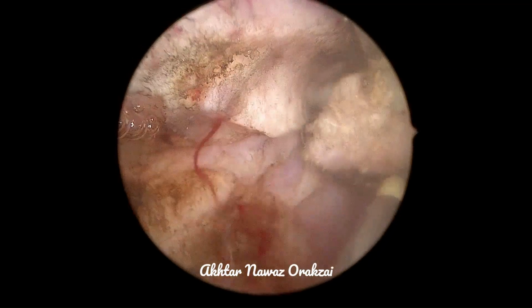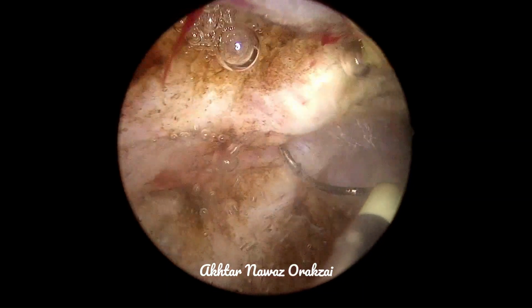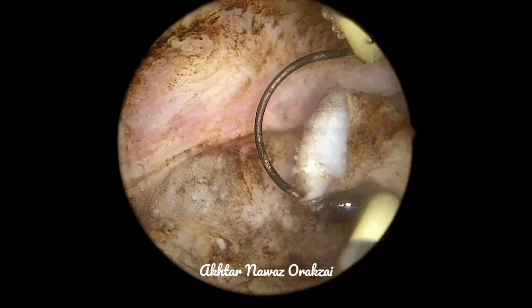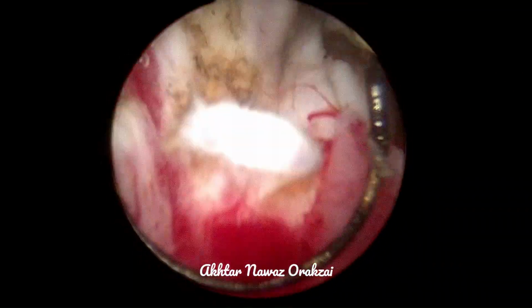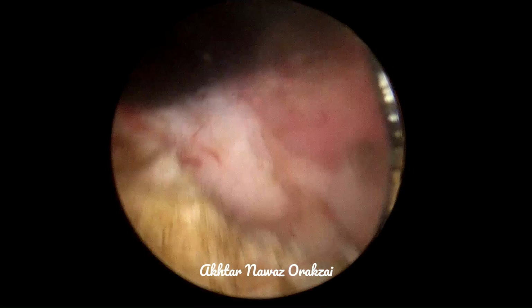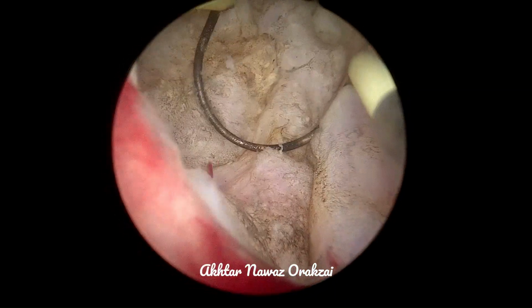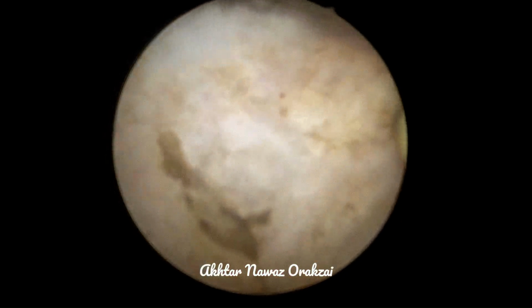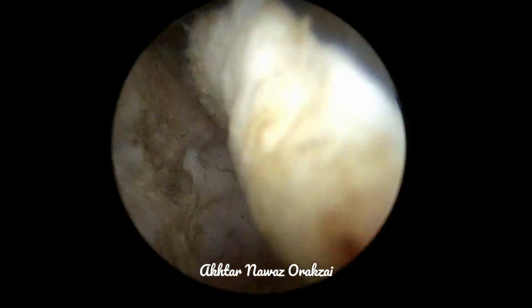So when you are resecting a big sized prostate, you tend to resect deeper, and this may lead at times to a breach in the capsule. Once there is a breach in the capsule, this may lead to a few things.